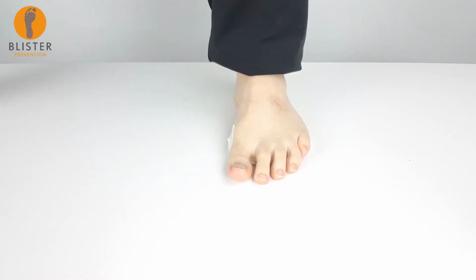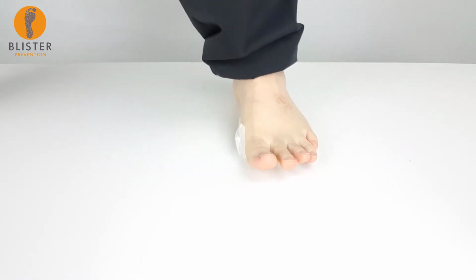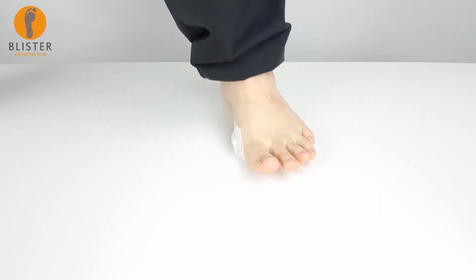On my other foot, I used a large rectangle pad right across the ball of my foot and started to do some star jumps. This was awkward to say the least because the gel was too much. The shear modulus was too low for this part of my foot for this kind of activity. Why? Because your foot relies on traction to perform star jumps, just like it does for walking and running and changing direction with any efficiency. The problem is this hydrogel worked too well. It absorbs so much shear that it degrades your efficiencies of gait, including braking and acceleration forces.